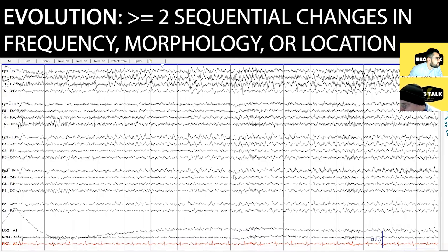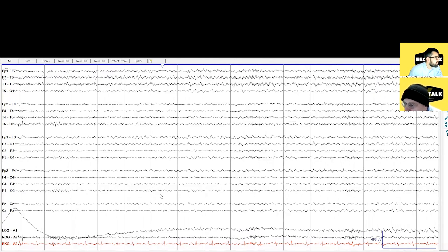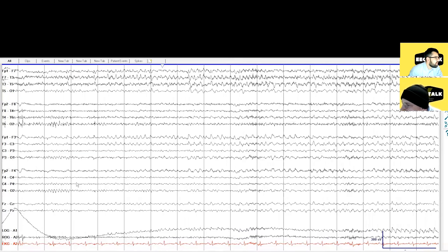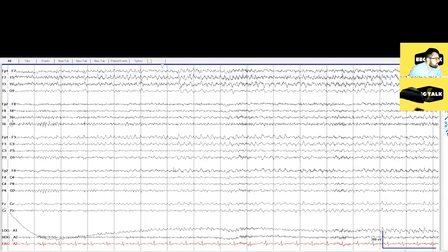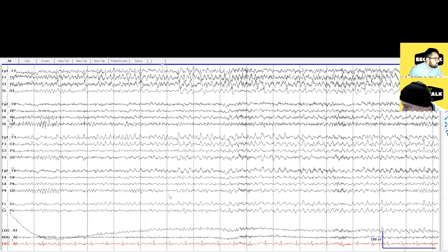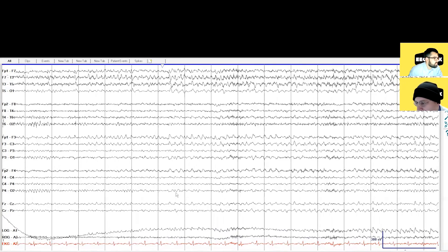Is it recruiting, spreading spatially? Before we do that — look how interesting, she still has a PDR. Yeah, so this is a pretty focal seizure, pretty well localized, that even the alpha rhythm can survive while this is happening. The alpha on both sides still persists, at least for a little while. It's gone on the left side, though I think there may be a remnant at P4O2. This is clearly a localized event on the left side, somewhere in the anterior region.